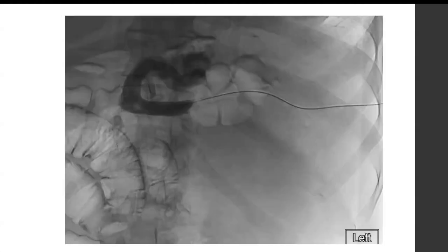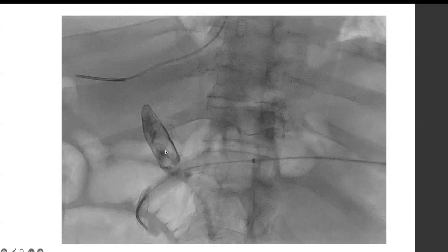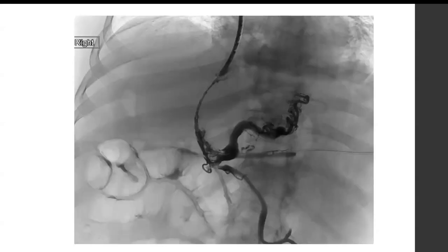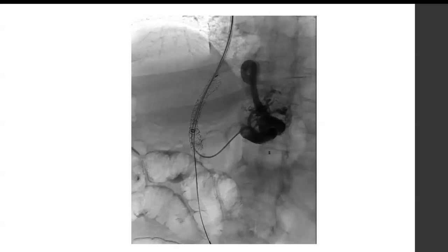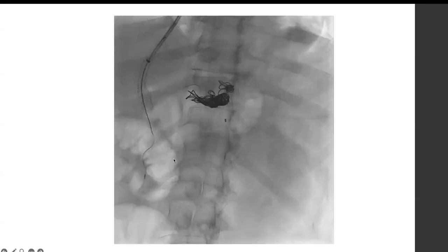So basically, was able to, I don't think I have an image, but put up a target, like maybe it was a balloon or something in the portal vein there, and then got access through like you're doing a TIPS. Well, we are doing a TIPS, same thing. And you can see this acute clot here, and then placed the TIPS. Oh yeah, so once we got there, there's clot there obviously, and it's acute clot.